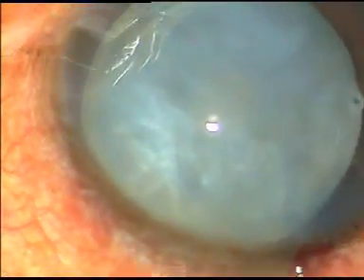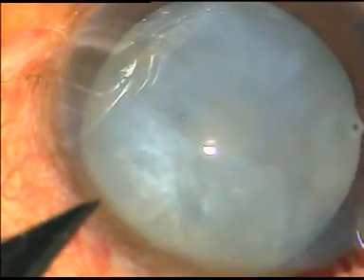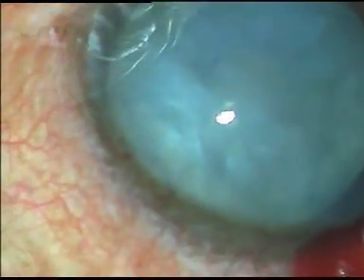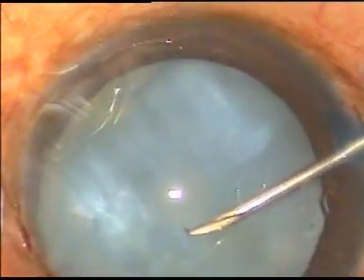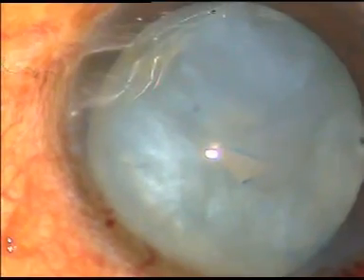Another side port is made at around 2 o'clock for introducing the chopper. Now capsulorrhexis is to be done. A bent cystotome is taken, and an incision is given right at the center of the intumescent cataract.